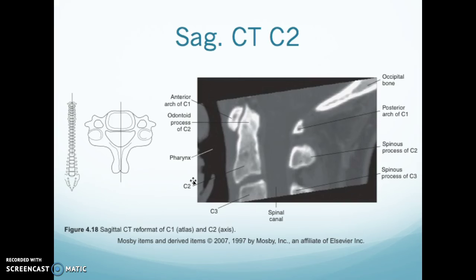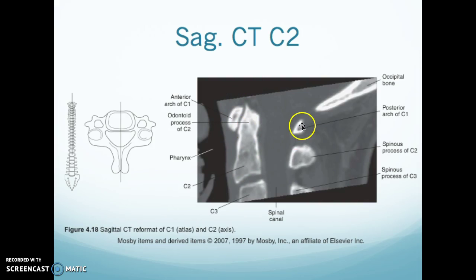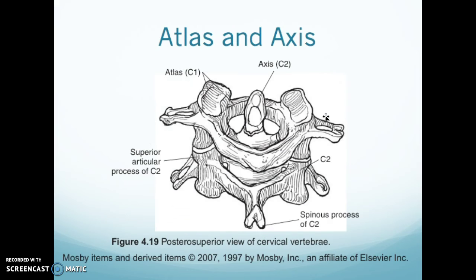This is a sagittal view CT. This is your anterior arch of C1, and this is C2 with your odontoid coming up. Here's the posterior arch of C1 and the spinous process of C2, and this is your occipital bone coming down. This is a reformatted image looking at C1 and C2 where it fits together — it just gives you an idea of how it all comes together.